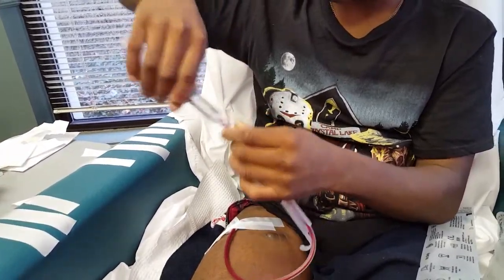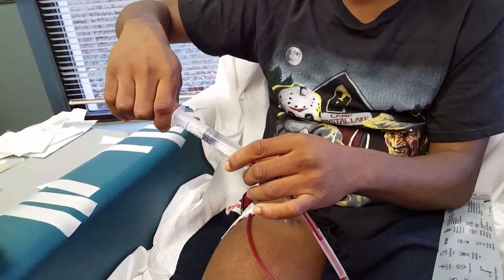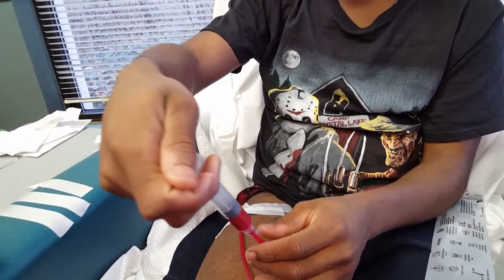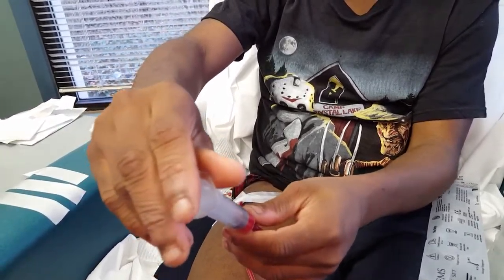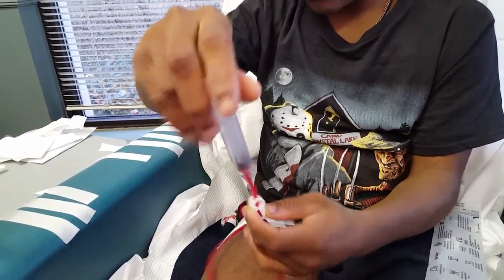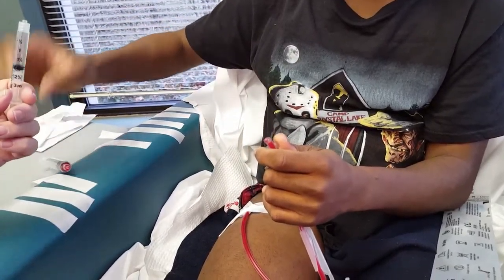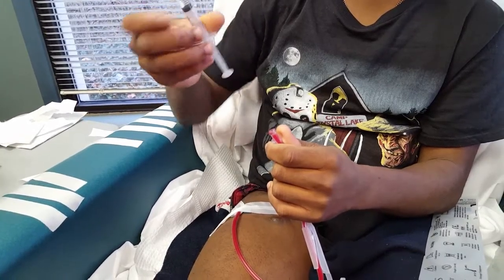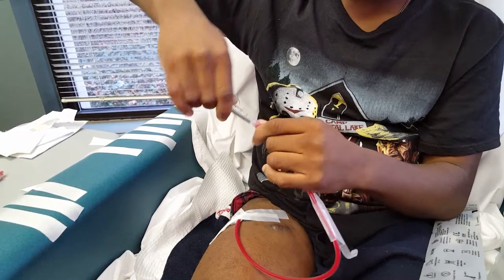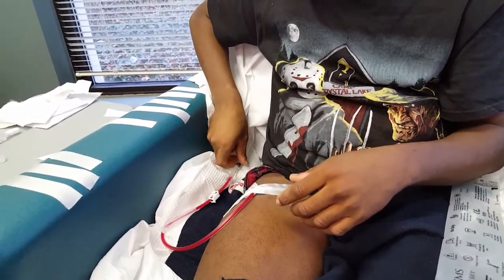And I take this and flush this, because if I don't flush it and keep saline in it, then it will clot, and then we wouldn't be able to use it. Then I would have to go to surgery and have that looked at. So then we clamp. And now what do you do? Then we put this blood thinner, called heparin, on there. We don't flush it yet, so we keep it clamped. And then we put this aside.